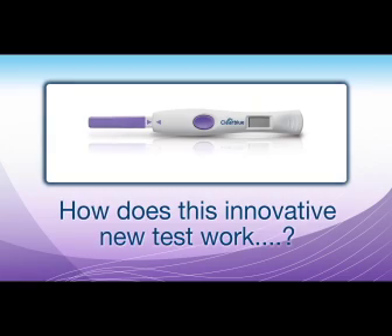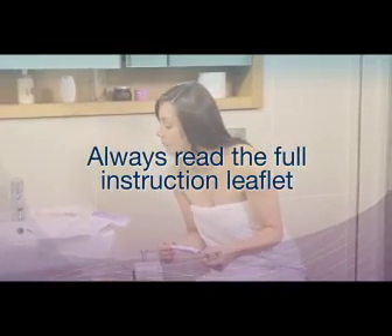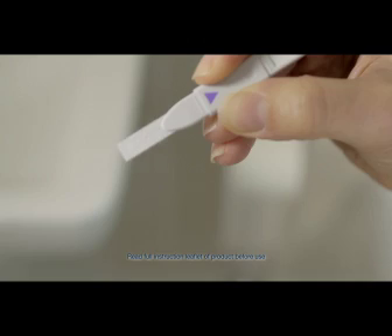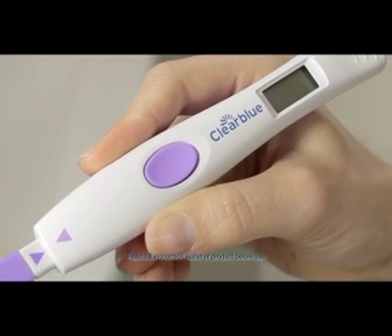So how does this innovative new test work? The day you need to start testing depends on your cycle length, and the instruction leaflet provided will help you work this out. Test using the first urine after your longest sleep. Take a test stick out of its foil pouch and take the cap off. Insert the test stick into the holder, lining up the purple arrows, until it clicks into place.